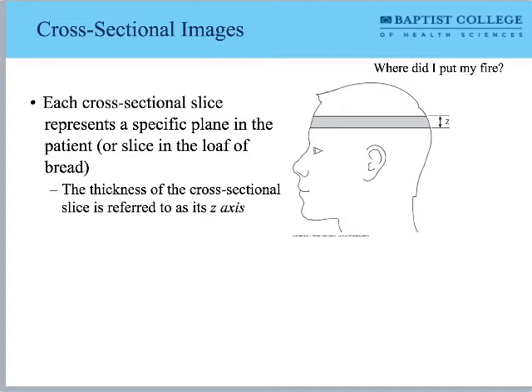I'm going to raise this table up, and I'm going to fly it through the big donut hole, right? As they're flying through that donut hole, the direction of travel through the donut hole is the z-axis, right? The z-axis is their direction of travel. As this table lifts up and flies through that donut hole, the z-axis is the direction of that table's travel. That will always be the case. It's generalizable. Every CT scanner you ever work on, that will be how it works. Of course, I think radiation therapy made it confusing. Bell's table is a little bit different. I think ours is the same. The z-axis is the same.